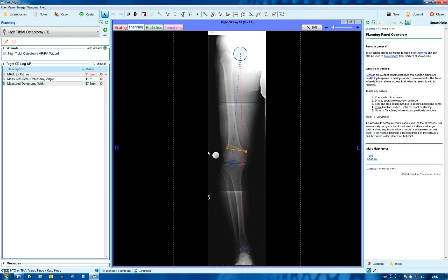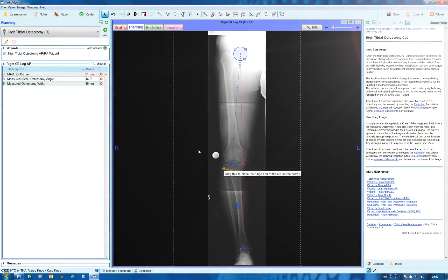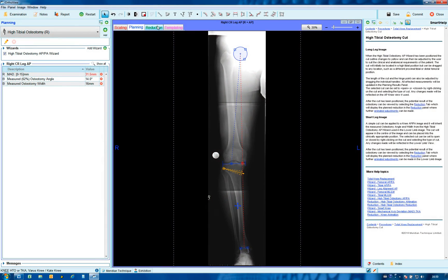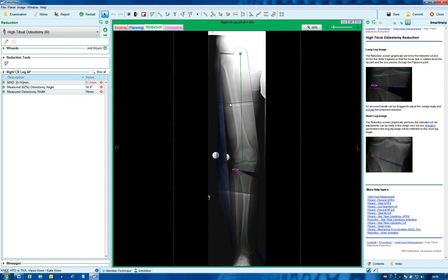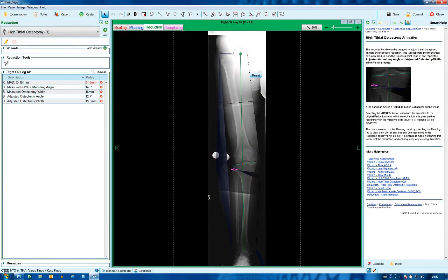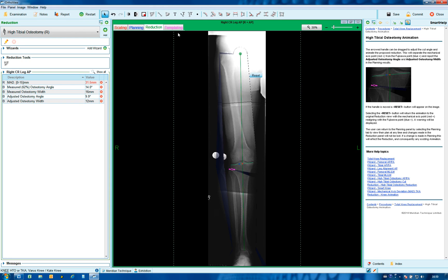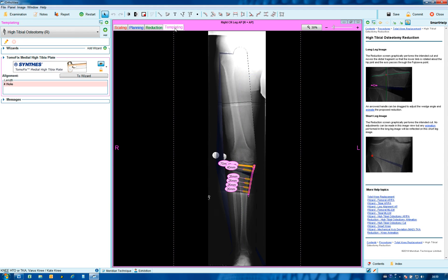As with the open cut, choose reduction to see the planned post-op alignment of the limb. Returning to the original plan, move to reduction and adjust a little more medially.